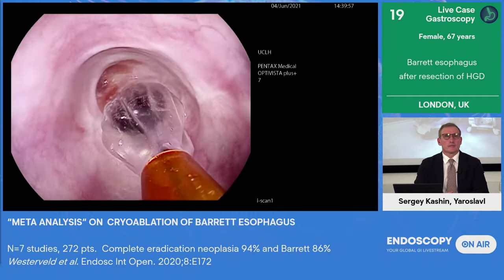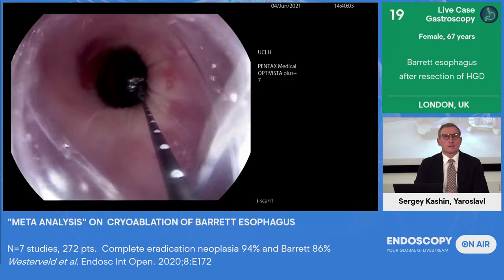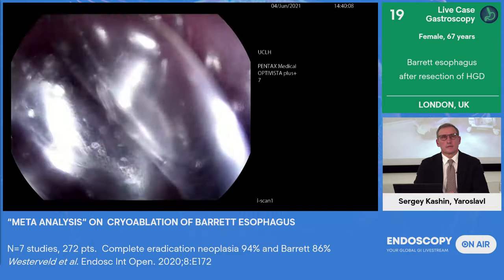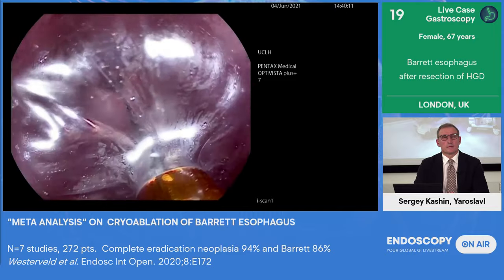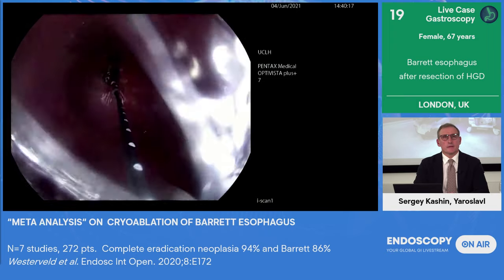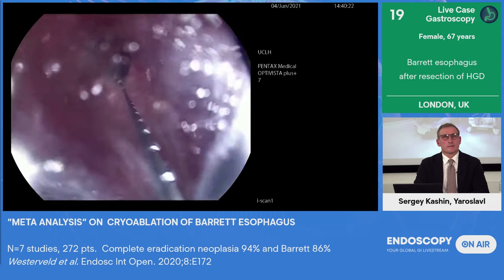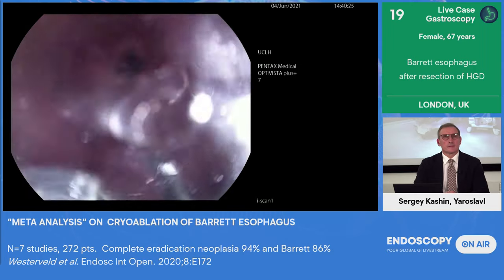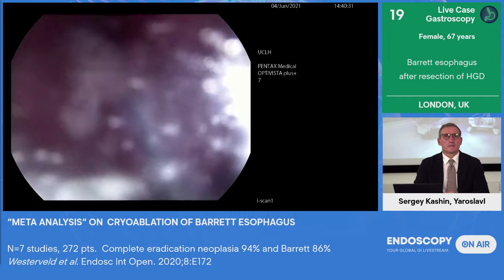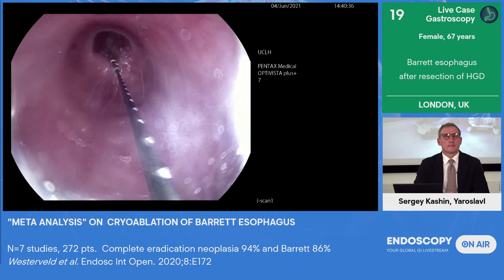So I've blown up the balloon here, and what I'm trying to do is get a nice stable position within the stricture, and I'm going to use my scope to angle up to the tip of the balloon just to get a good visualization and allow me to start the ablation. So what this new generation of catheters allows you to do is, you can see that in the sort of 1 o'clock position along the rim of the catheter, there are these little white spots, which is a new addition. And I really commend the company for doing this. And what this allows you to do is, on my foot pedal, you'll see I can move the catheter around.